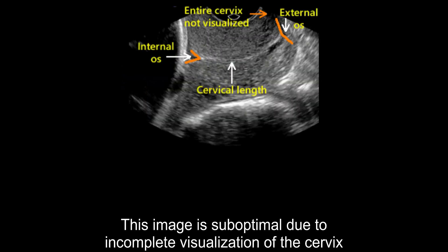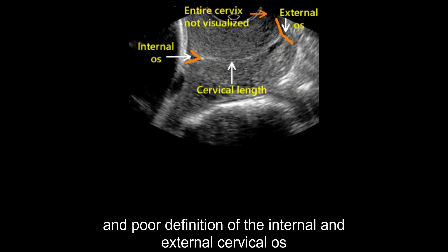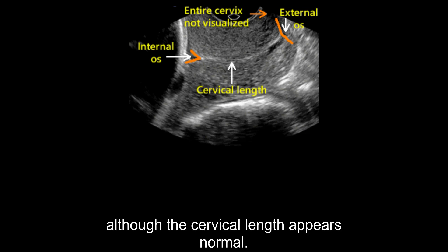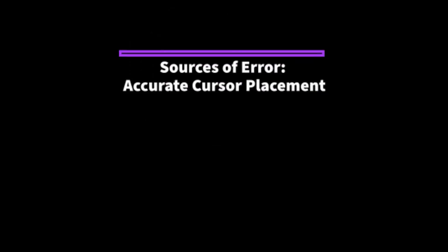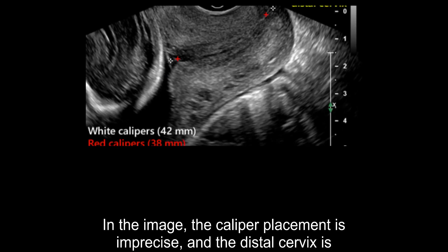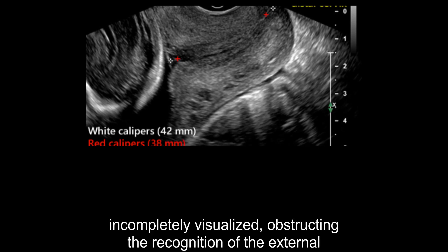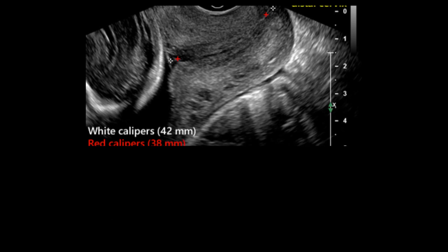This image is suboptimal due to incomplete visualization of the cervix and poor definition of the internal and external cervical os, although the cervical length appears normal. The caliper placement is imprecise, and the distal cervix is incompletely visualized, obstructing the recognition of the external cervical os.